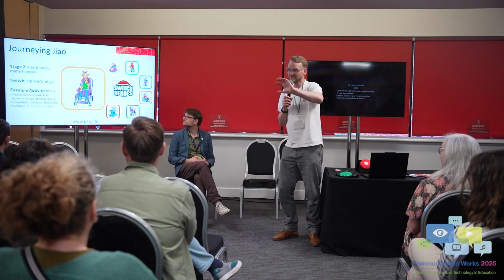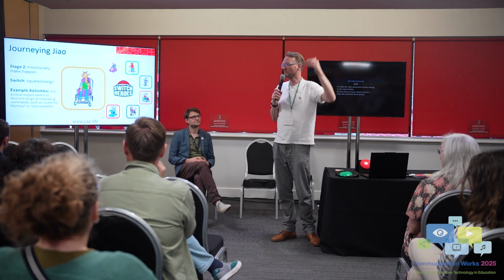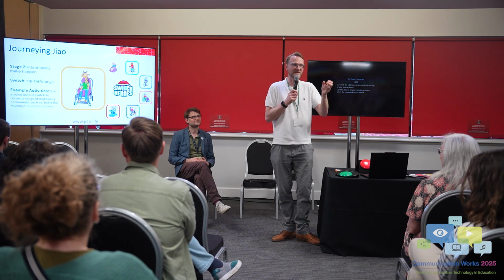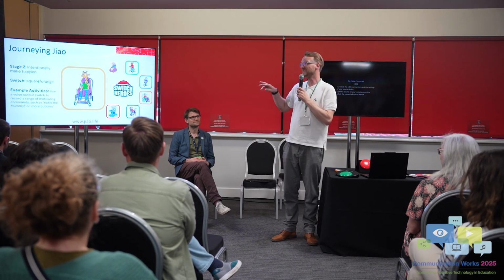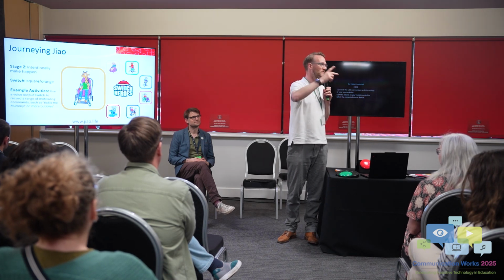So we want them to have an aha moment, and when they do that, they've really started their journey. So they're exploring, now they're starting their switch journey, so they have this realization that when they press the switch, something happens. So they're intentionally pressing the switch to make something happen. And this stage is kind of two: we start with a cognitive stage, and then we move to the physical.